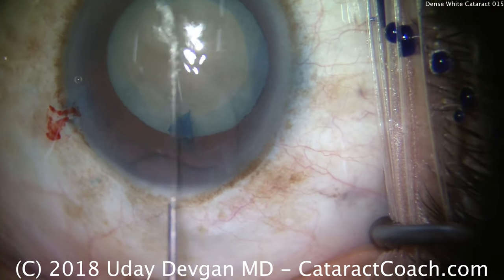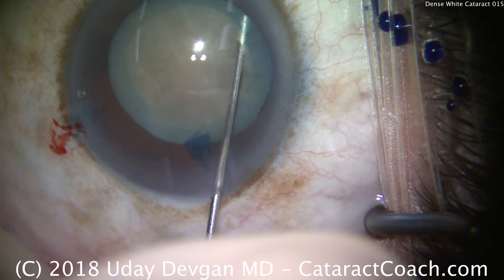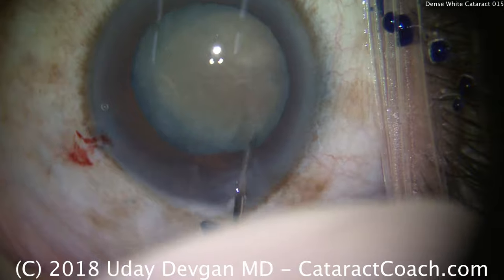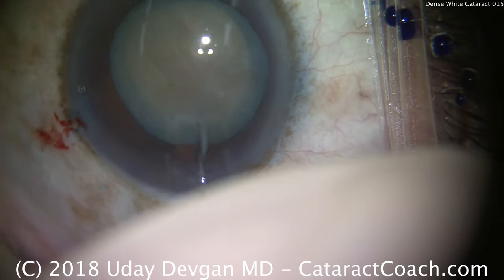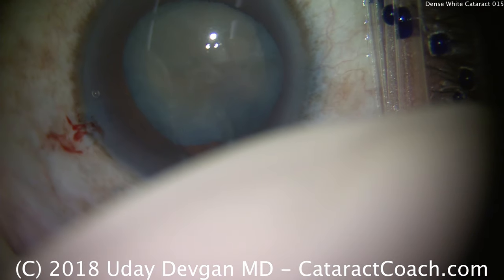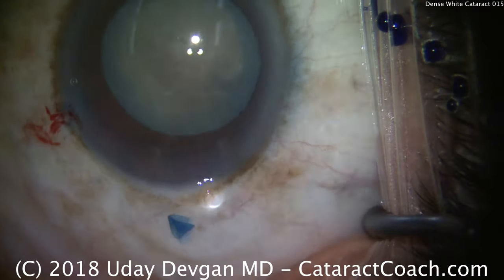Be careful in hydrodissection because you can't directly see the fluid wave. So I do a very tiny amount, a little bit at a time. And as soon as I can rotate the nucleus like that, I'm pretty much done. So we don't want to do a lot of hydrodissection because you can't directly visualize it.